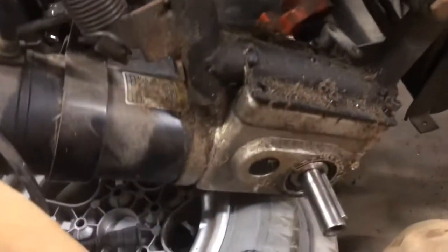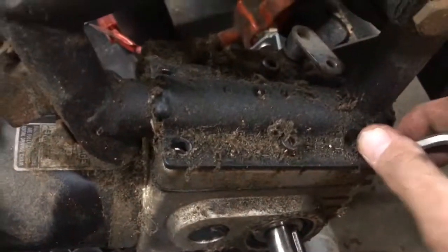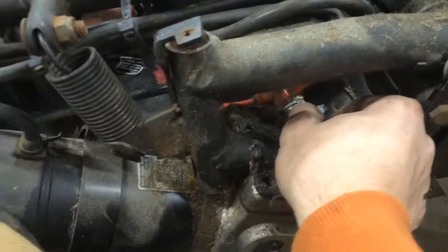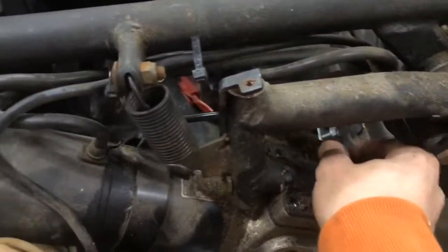Okay, let me see if you could. Yeah, you've got just maybe a tad bit, so it'll be extremely rough. You may have to take it somewhere to get it torched off if that's the case. Anyway, they should have given you more room in here to work with. So I'll go ahead and get these last two out. Okay, let's move on.